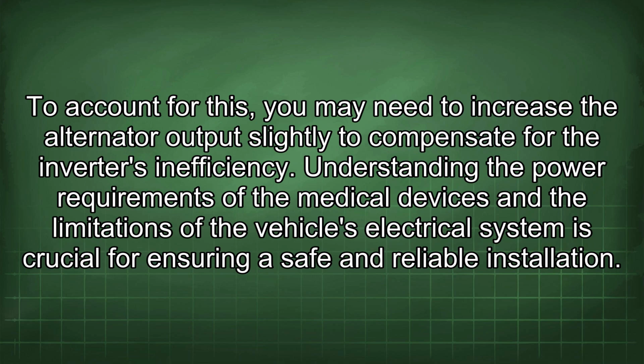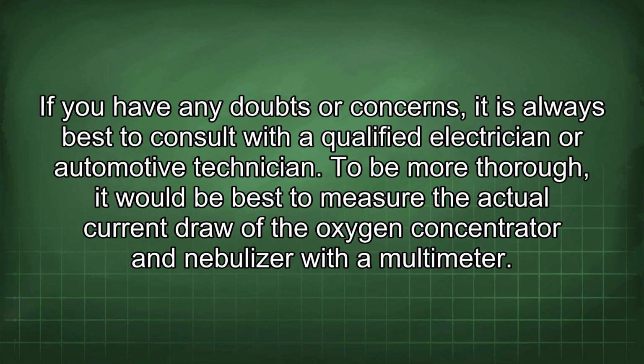Understanding the power requirements of the medical devices and the limitations of the vehicle's electrical system is crucial for ensuring a safe and reliable installation. If you have any doubts or concerns, it is always best to consult with a qualified electrician or automotive technician. To be more thorough, it would be best to measure the actual current draw of the oxygen concentrator and nebulizer with a multimeter.